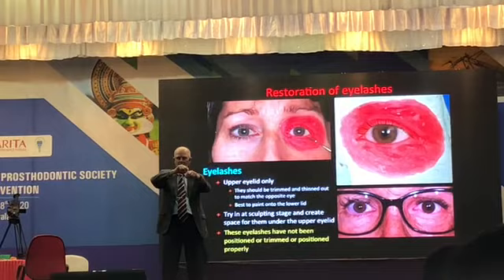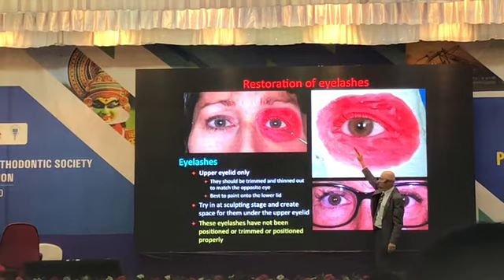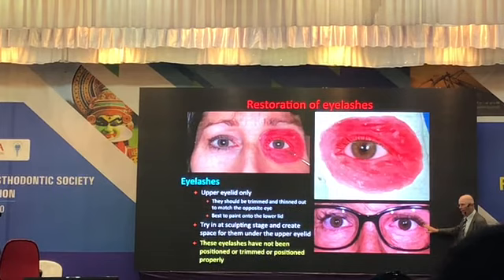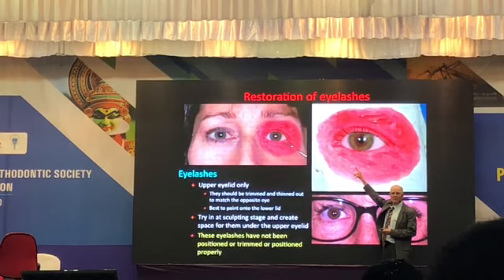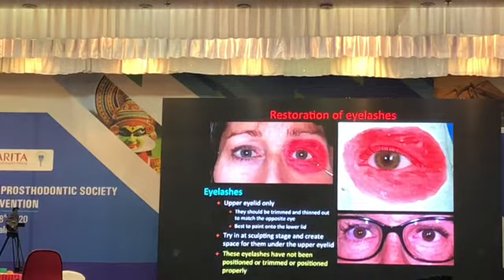There's a single thread, and then the lashes are sewn to that thread, right? Well, you have to stick that thread underneath the wax here. See, space was not made for the lash here. There's no space to tuck it underneath the upper lid, so you see this black line, which is not normal. Here, I've stuck the fake lash underneath the wax pattern lid to create the space for it. So all you see are the lashes. You don't see that little single line that the lashes are tied to. I don't expect the men to understand what I'm talking about, but the ladies do, right?